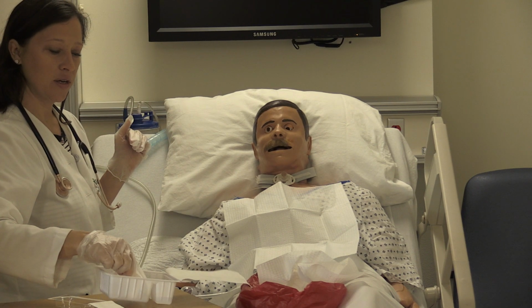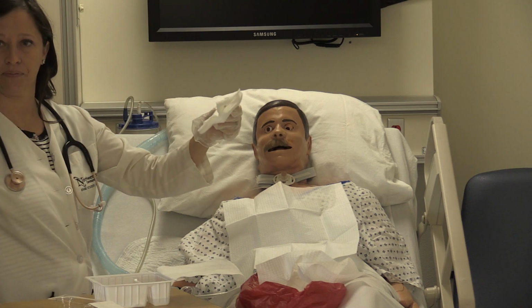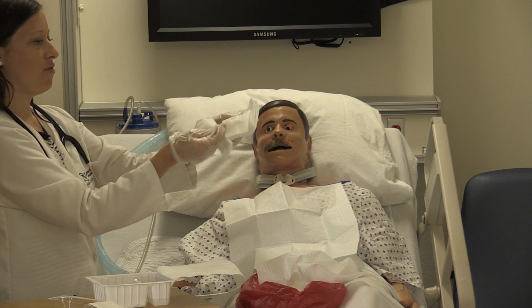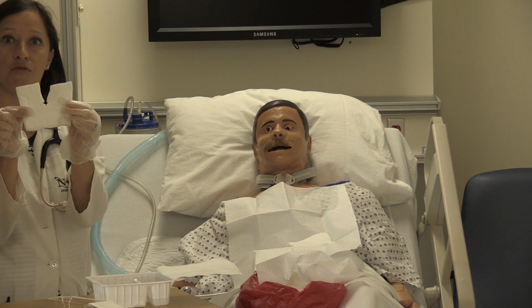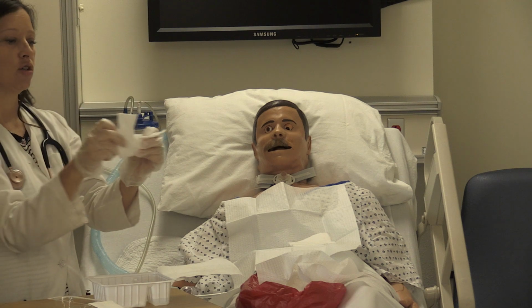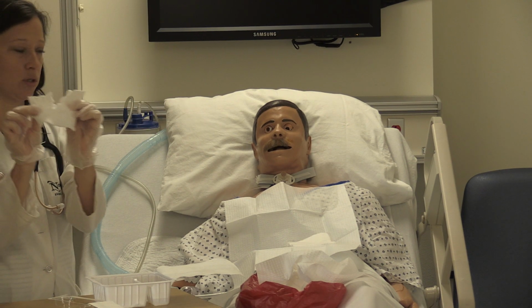And then you want to pick up whatever dressings you have left here. So start setting up my sterile field. You have a 4x4 dressing if you need it, and then you have a 4x4 split gauze pad. So you want to keep the center of this very sterile. This is the most important part.